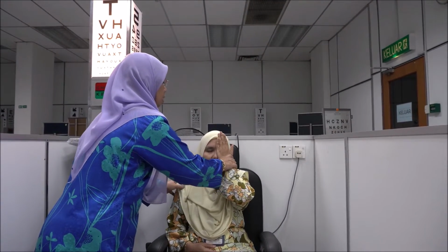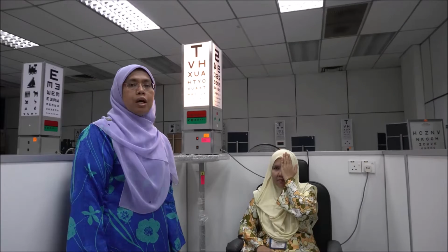Ask the subject now to occlude her left eye using the left palm of her hand. And now we can start the visual acuity measurement using the Snellen chart. Now we ask the patient to read the letters from the Snellen chart.